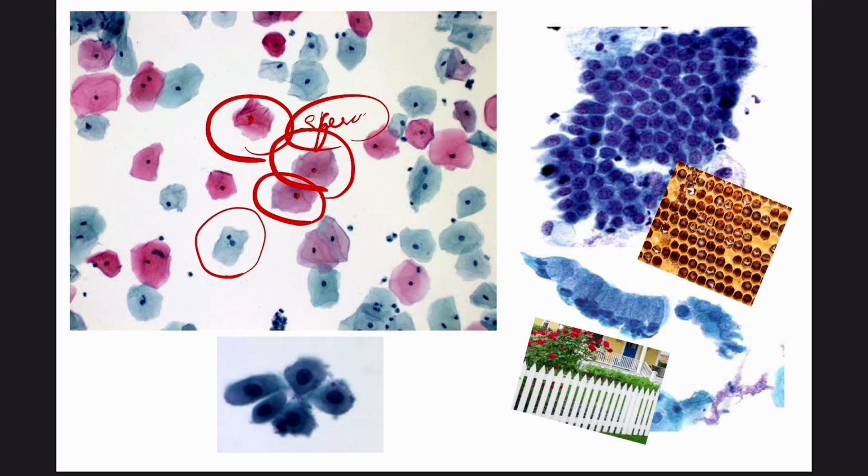Intermediate cells are similar to the superficial cells, large and polygonal, but the cytoplasm is basophilic and the nucleus is slightly larger. Parabasal cells are small and round with scant basophilic cytoplasm, and the nucleus is larger compared to superficial or intermediate cells.